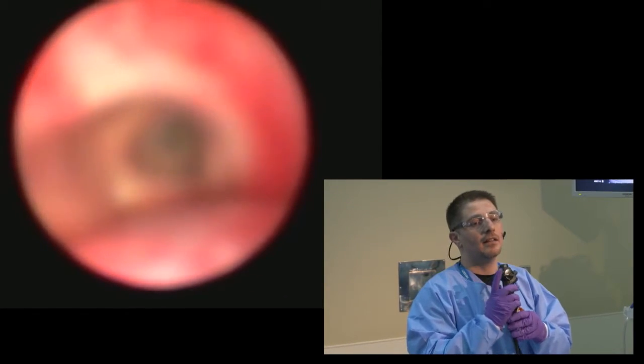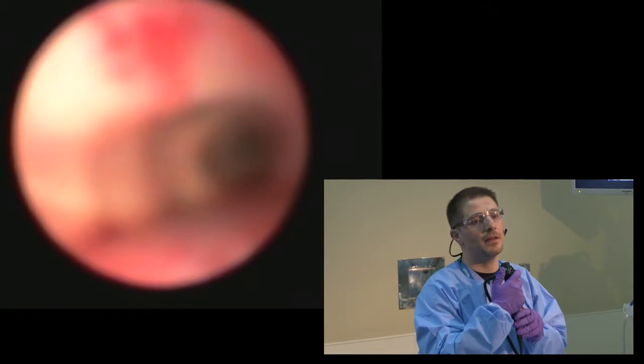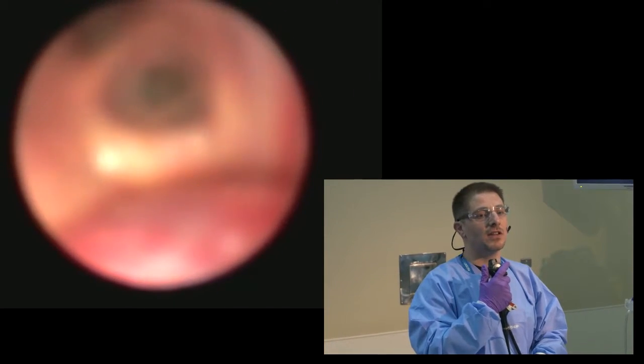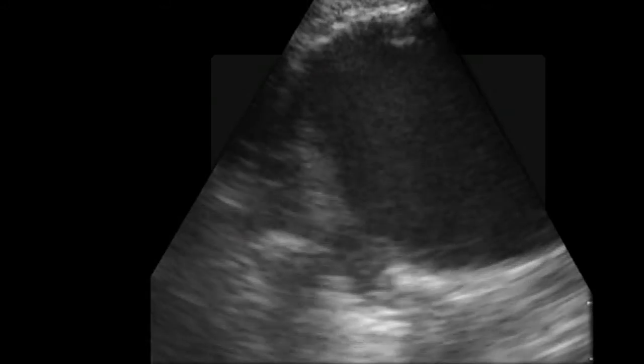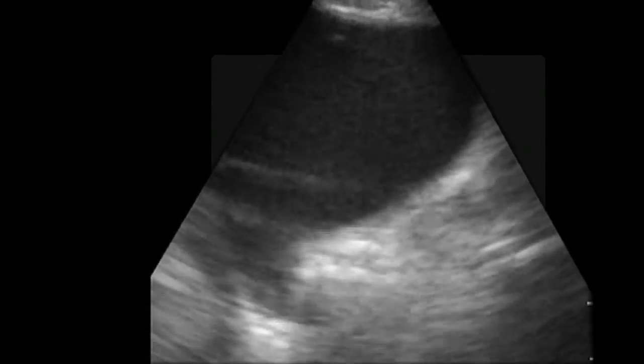Now we're going to identify the next station on the left side, since the lesion is on the right side. This will be the left paratracheal, the 4L location. To identify it, you start from the left main stem. When you see the left upper and the left lower, as you see in the endobronchial lesion, then you touch the wall, and you can see a major blood vessel, which is the pulmonary artery.